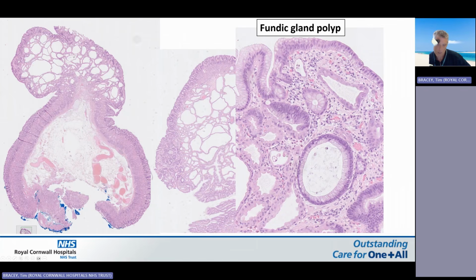You can see this almost like apocrine blebbing of the cytoplasm into the lumen here, and a few macrophages here, and sometimes the epithelium of the parietal cells becomes quite vacuolated as well, and that's another sign that the patient's on PPI. I've actually diagnosed one of these and written it up which occurred in the rectum within a patch of gastric heterotopia.